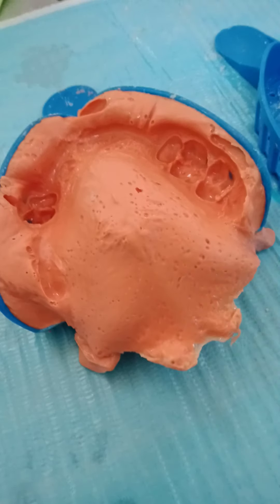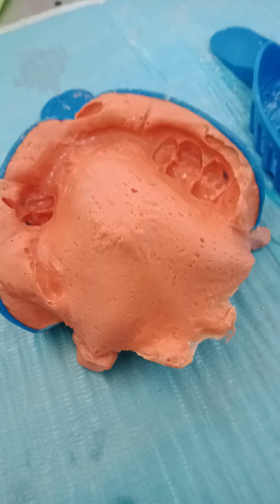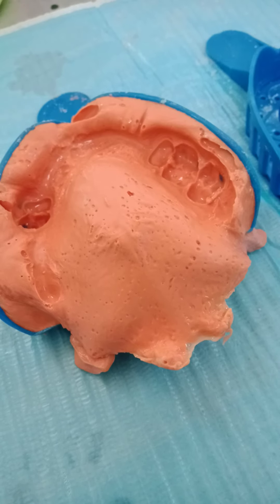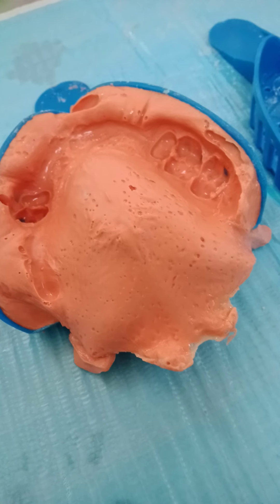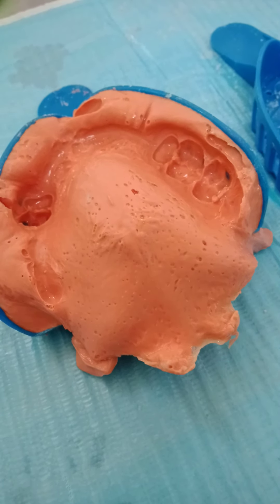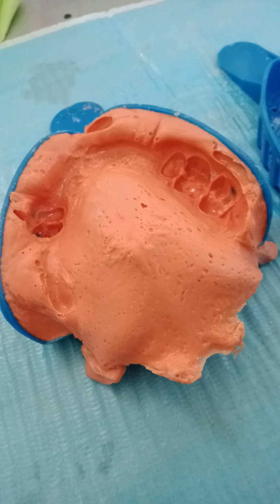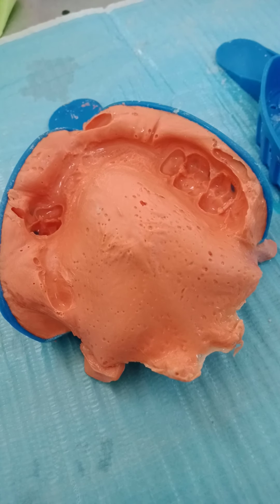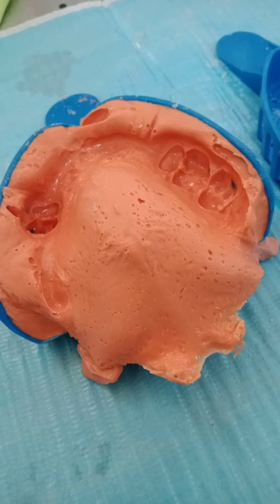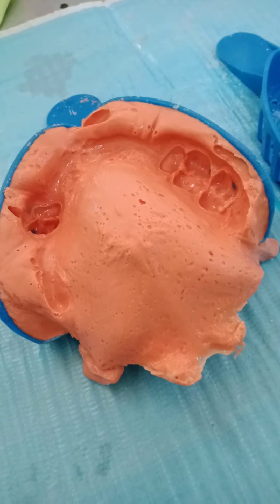Assalamu Alaikum. This is a case where we have a partial denture. The partial denture here was taken — we've taken a primary impression for it. The primary impression had many problems, and I recommended in the previous video that we do a special tray.